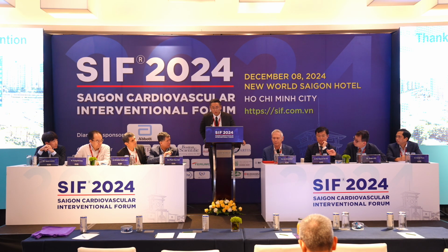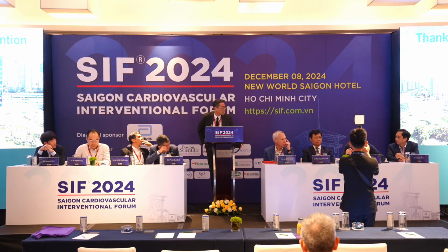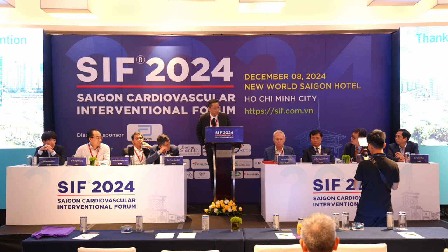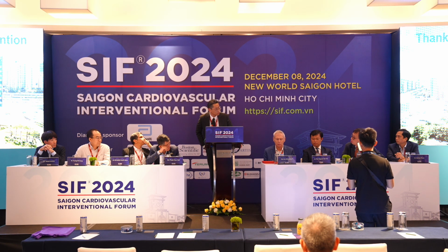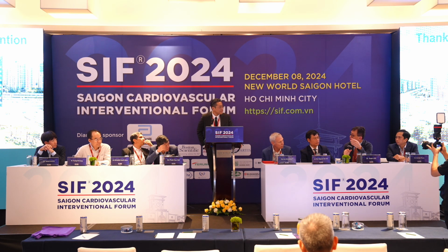Yeah. So during the stent ablation, the patient's vital signs were absolutely okay. So I believe that I started the rotational stent ablation with the small burr. Yeah. What rotation RPM do you use? Is it the same? Normally I use 180,000. 180. Yeah.